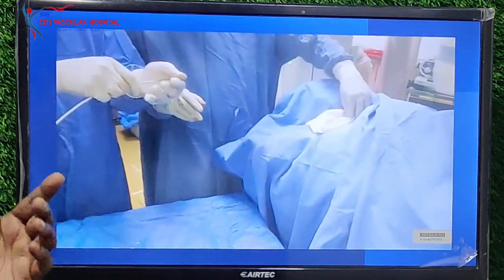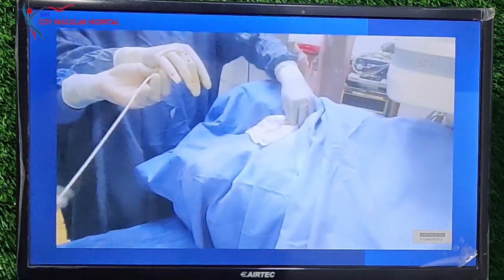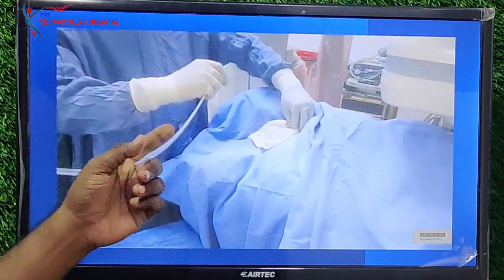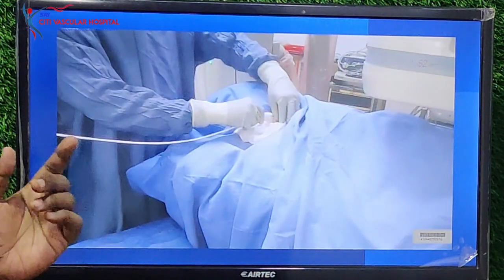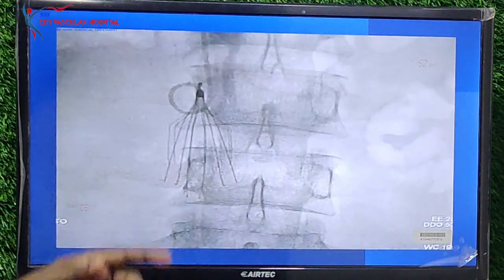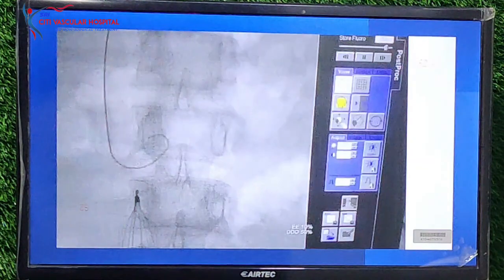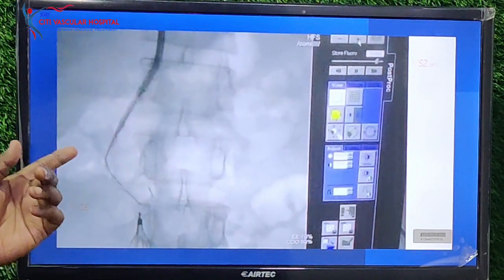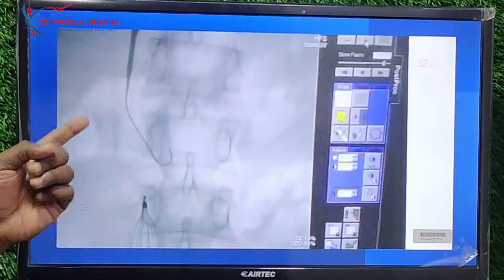There is no thrombus proximal to the IVC filter, which we will confirm with that. Once we are done, we will place a snare through this 8 French long sheath and try to snare the IVC filter. This is a pigtail run showing the flow in the IVC, and we have exchanged that with the 8 French long sheath over the regular wire.